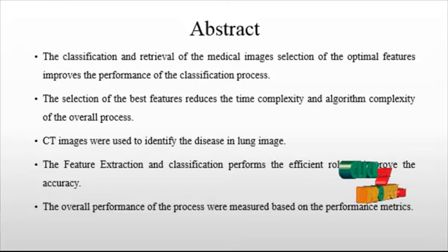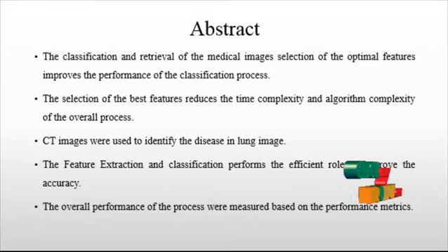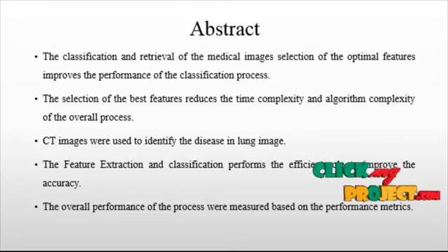Our method first inverts the relationship between the patients by using information retrieval techniques to determine the textual distance between the patients' radiology reports. This distance was subsequently used to supervise a metric learning algorithm that transforms the image space according to the textual distance. So CBIR systems with different image descriptions and different levels of medical annotation were evaluated.